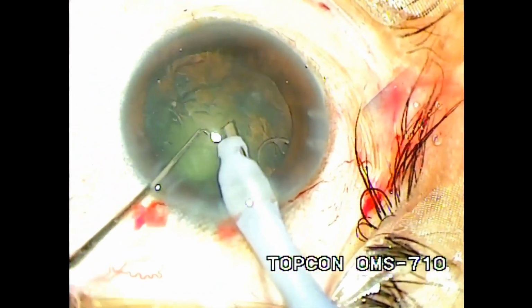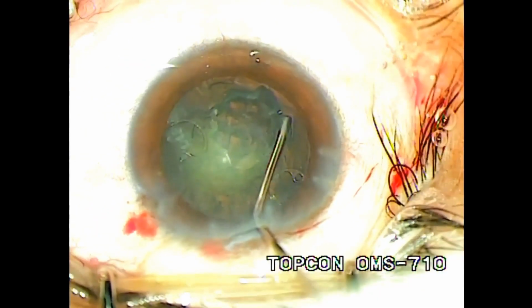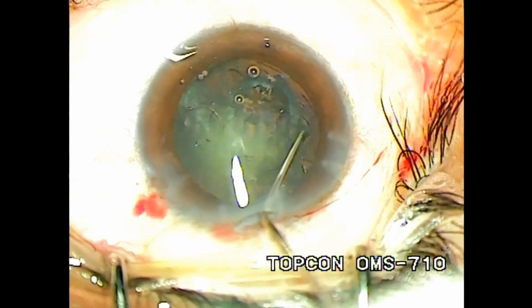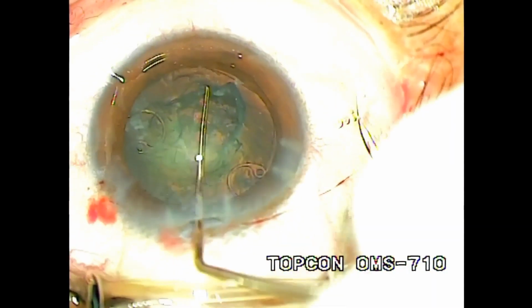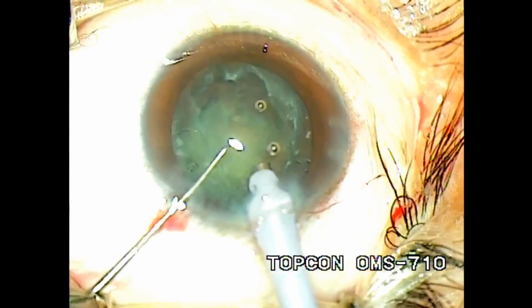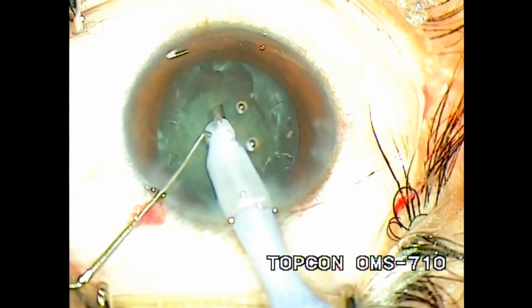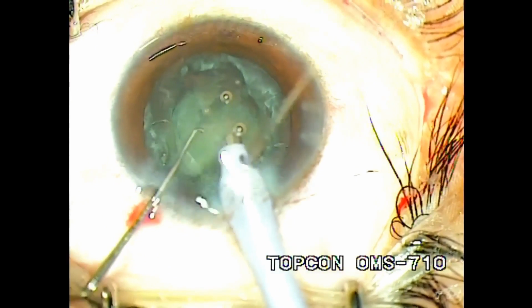Phacoemulsification should be carried out with low bottle height, low aspiration flow rate, and low vacuum. Care is to be taken to minimize the movement of the nucleus while sculpting. At no point should downward force be used, as it gets transmitted to the posterior capsule and to the zonules. If the nucleus is soft, phacoaspiration or the chip and flip technique should be used.